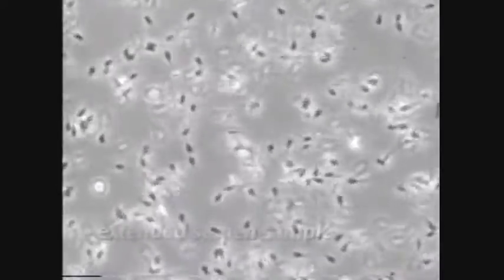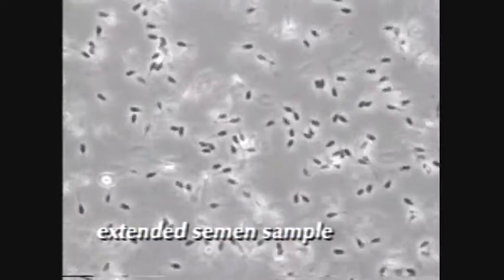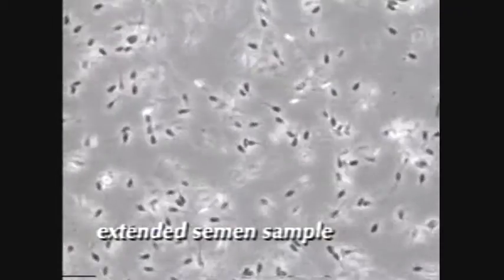Raw, undiluted semen should not be evaluated, as it is virtually impossible to make an accurate assessment of semen quality due to the high concentration. Likewise, the swirling motion observed in raw semen samples does not indicate motility of individual sperm cells and should not be used as an indicator of quality. Virtually all boar semen samples must be diluted with an extender prior to evaluation of motility.